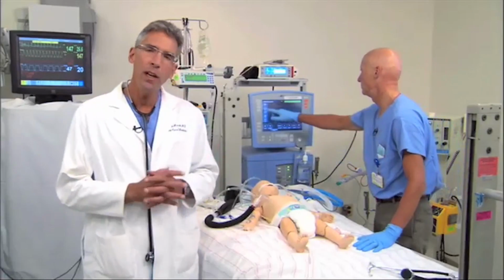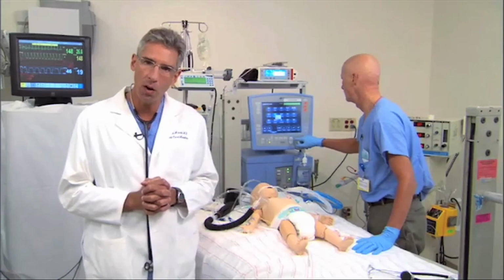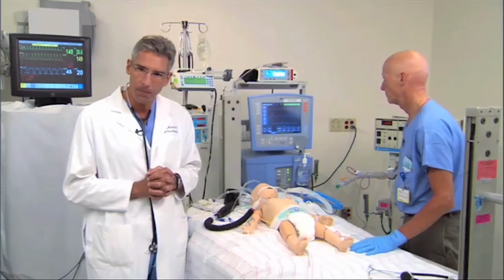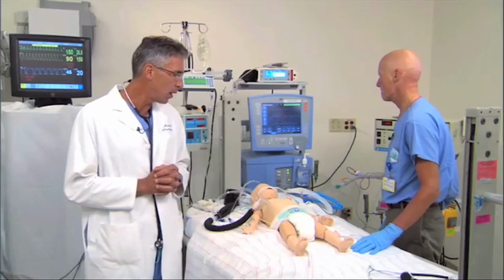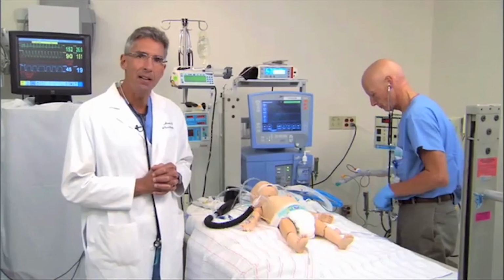Today, we'd like to demonstrate some of the fundamental concepts regarding the use of high-frequency oscillatory ventilation. I'm John Arnold. I'm an intensivist working at the Boston Children's Hospital. This is Barry Grenier, my colleague in the Department of Respiratory Care. We're currently caring for Samantha, who's a 13-month-old with a viral pneumonia who's been on escalating ventilator settings.